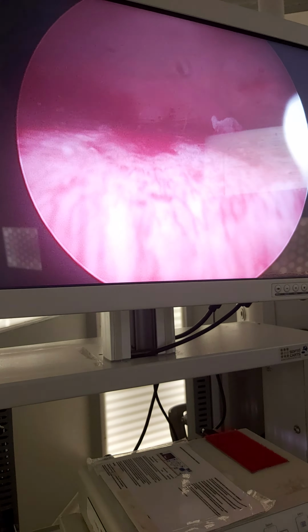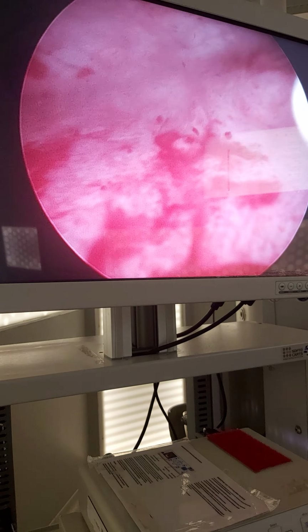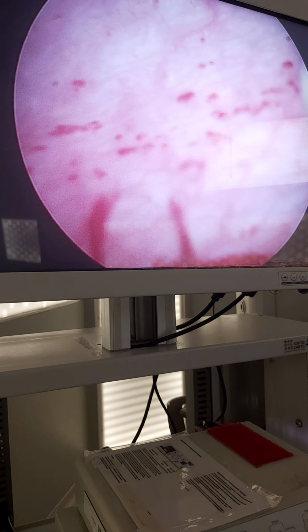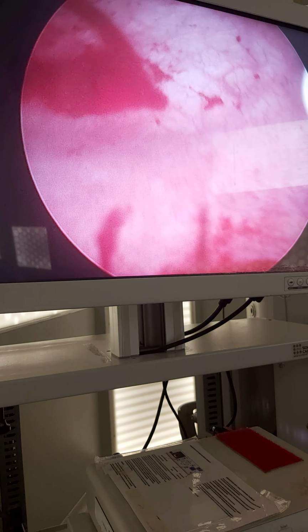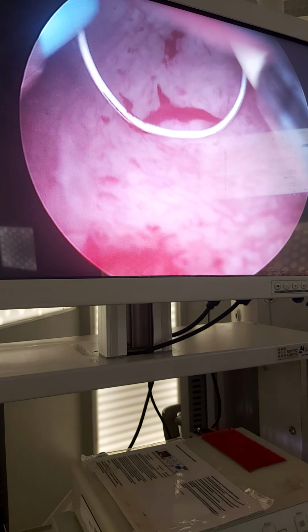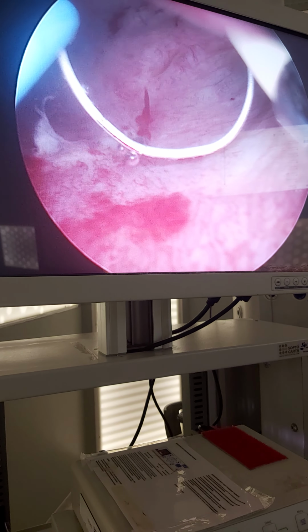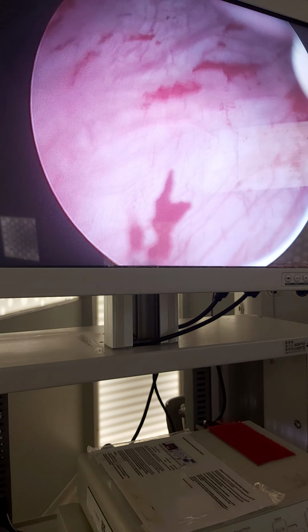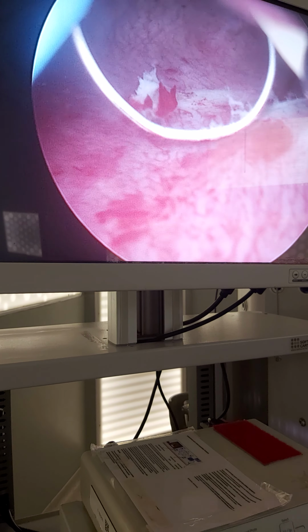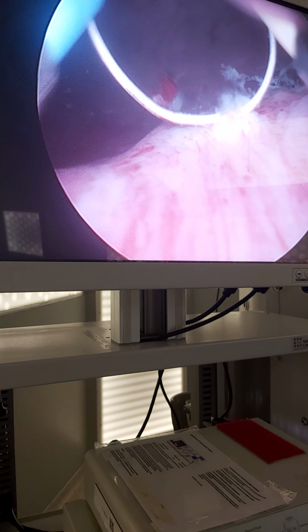It's bleeding more compared to other patients, but still, I know we will help this lady. I think it's an intermediate stage between interstitial cystitis and chronic cystitis. I am sure some of the interstitial cystitis patients change to this situation from chronic cystitis. When the inflammation is extreme, it passes to the next level from chronic cystitis and they become interstitial cystitis. For some of the interstitial cystitis, I am sure about it. But there may be other reasons too. So, I am now fulgurating these secondary.